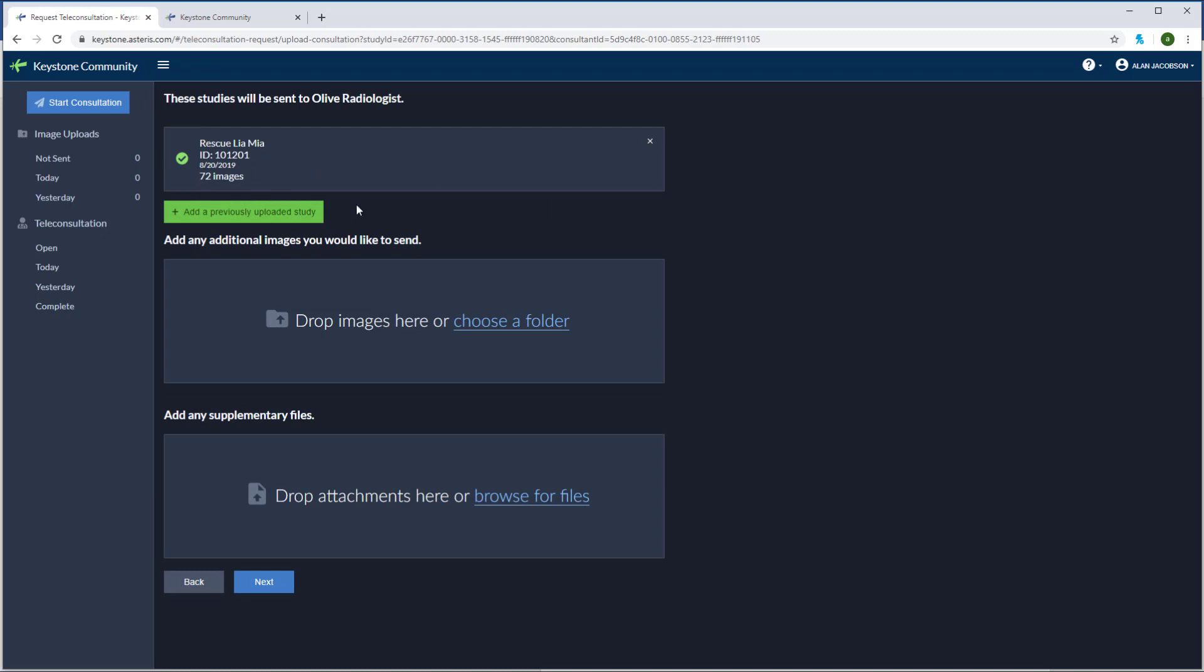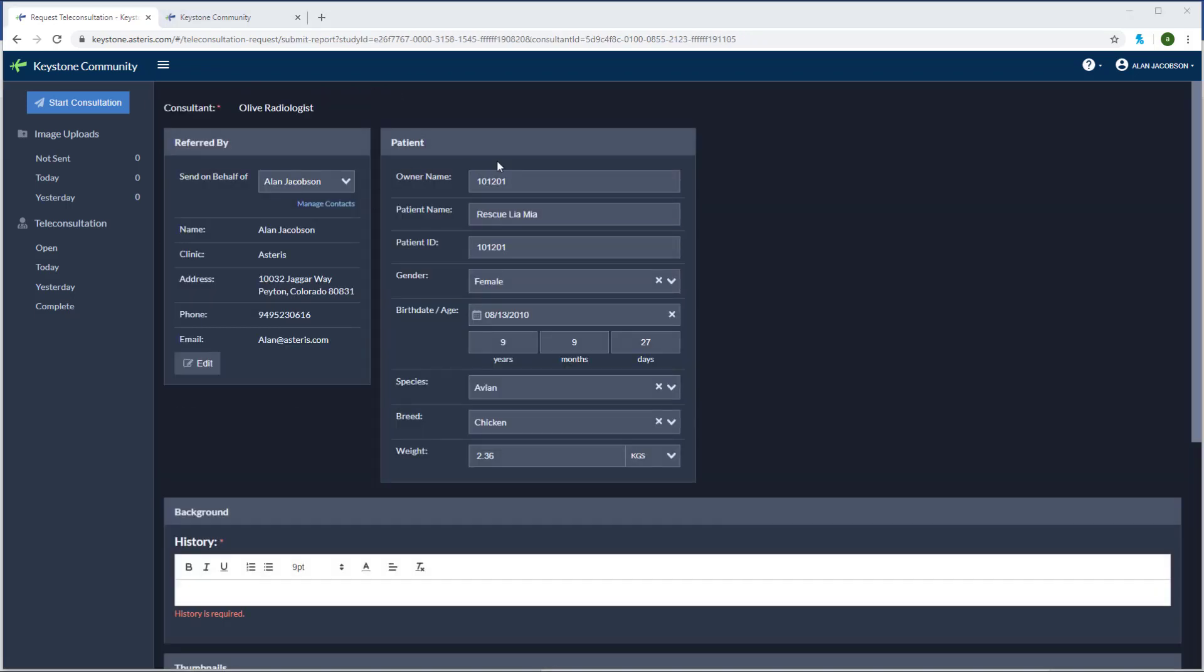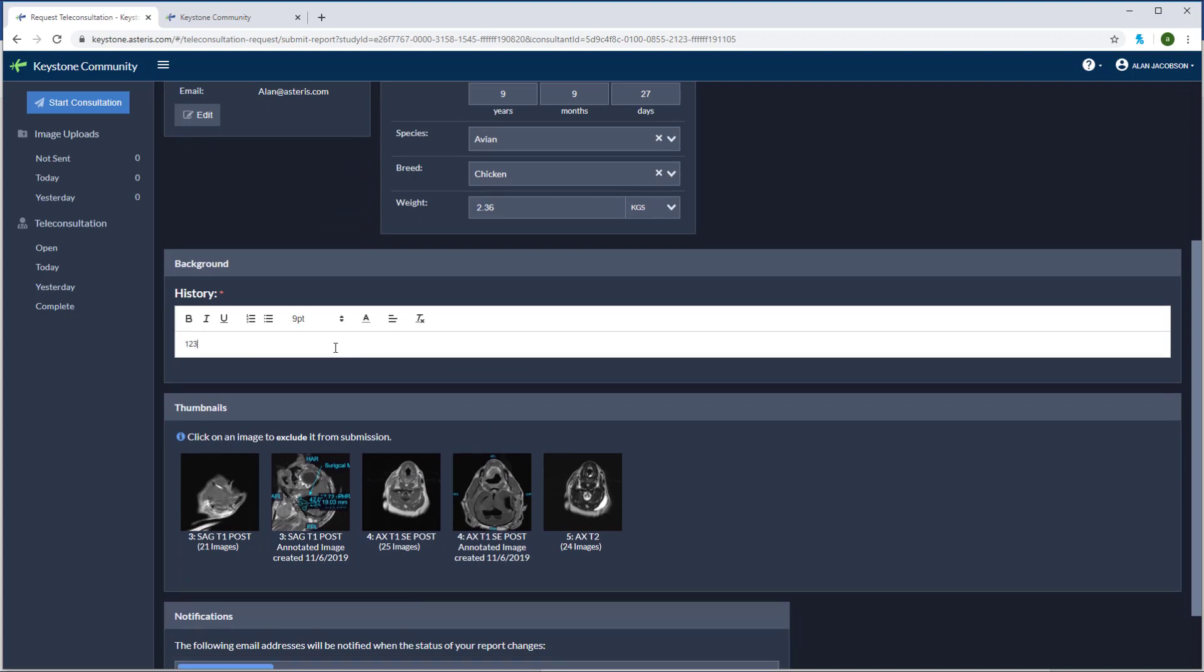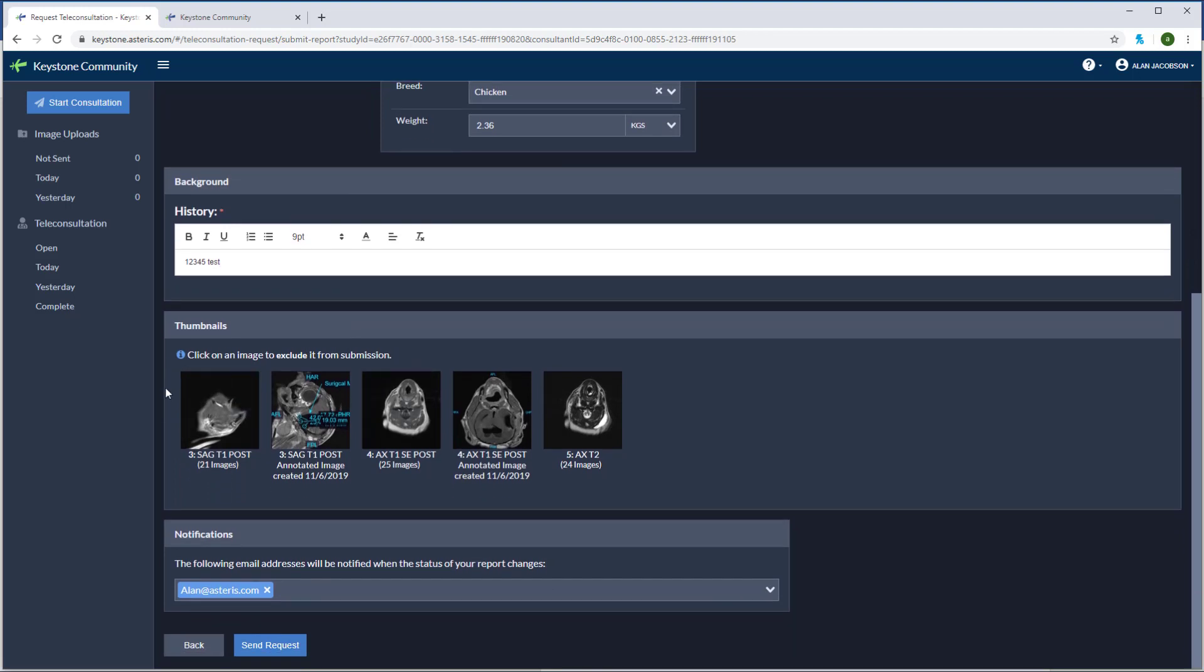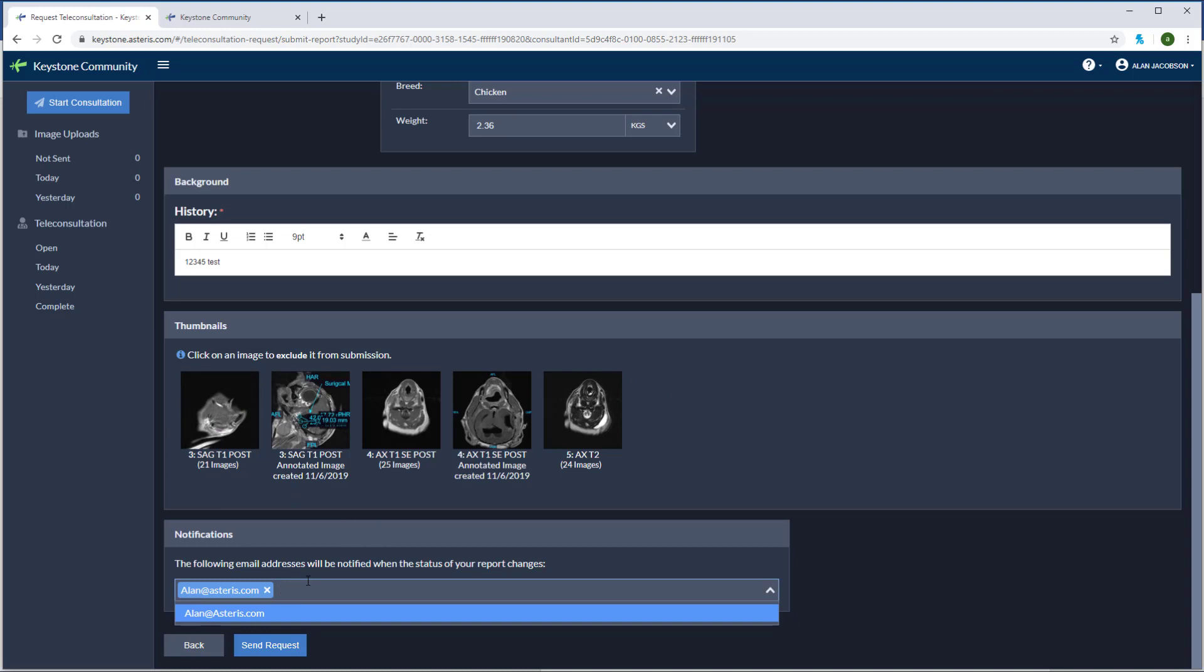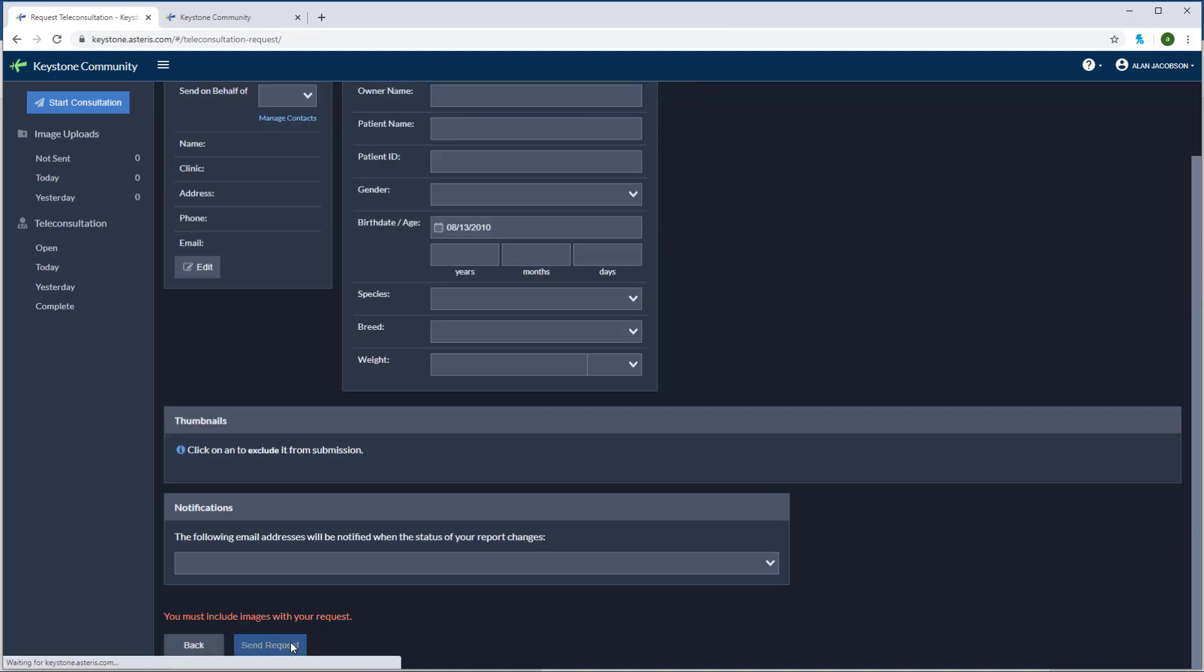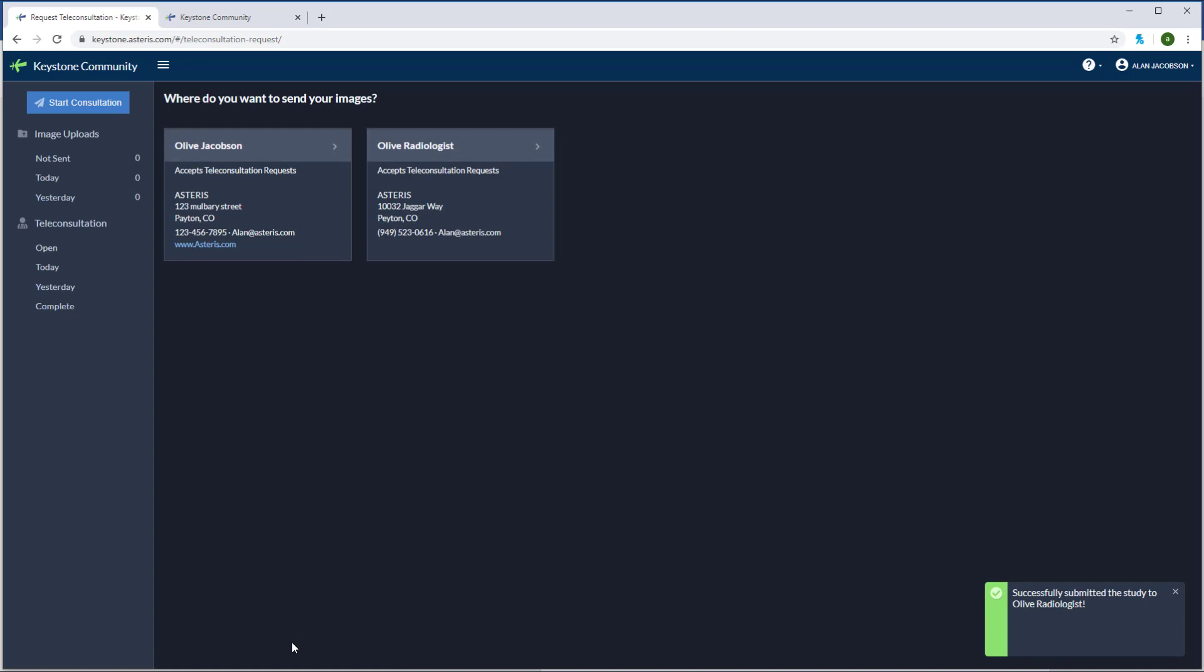You can see my images have now been added and I can add any additional images here in the drop box. I can also add any files or attachments here in the drop attachments. Once you've added any additional images or files, click next. Patient information will come from the modality. Make any changes here that are needed. Enter in any pertinent medical history below. Here are all the images that have come from our modality. We can also add any additional email addresses here. Now click send and the images that you collected from your modality are off to the consultant.